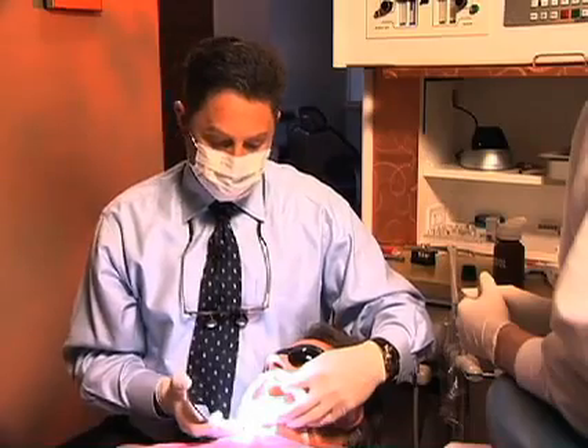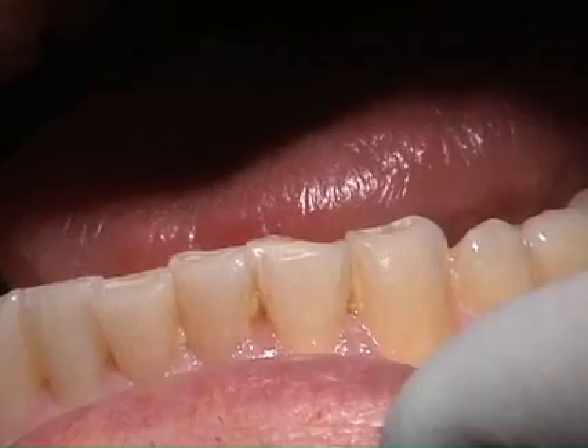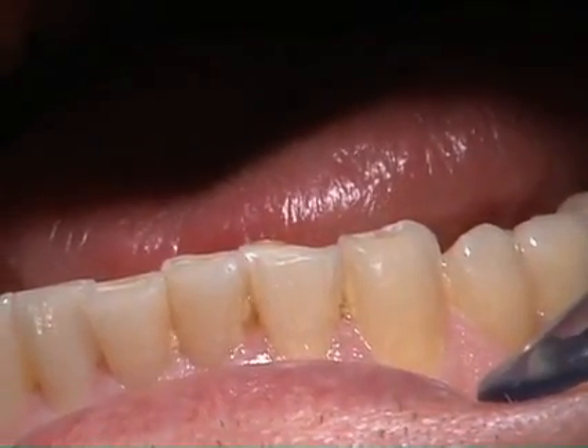As we do that, we're going to build the teeth up using a restorative composite material — Venus. When we build, we're going to build the teeth not in a shaded technique, but in an anatomical technique.